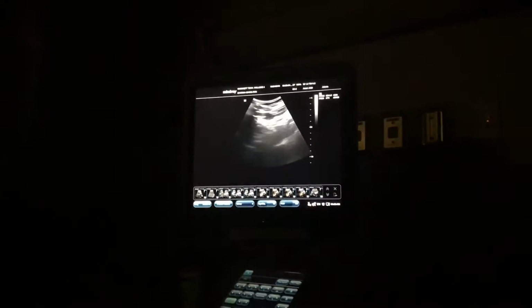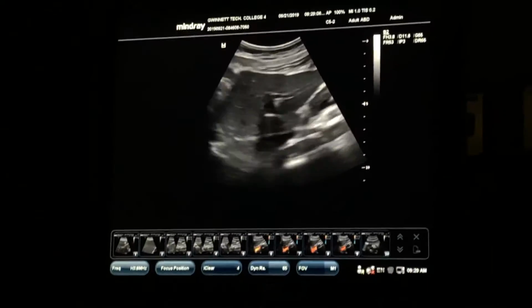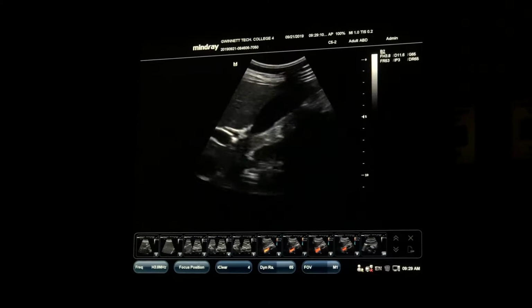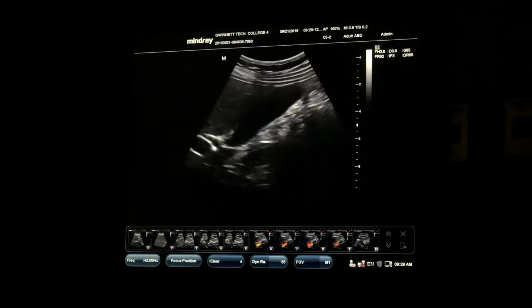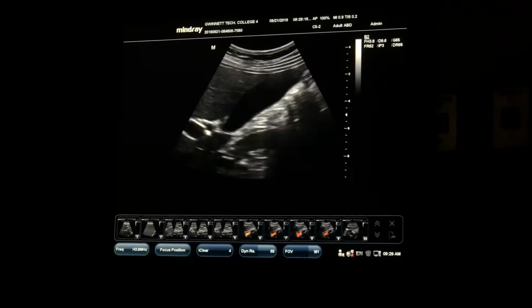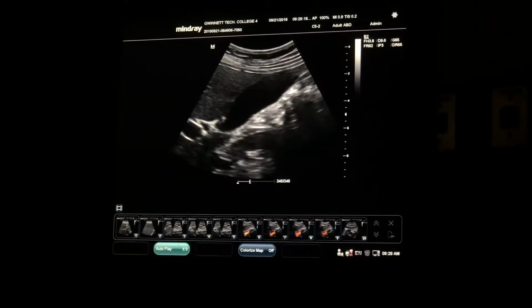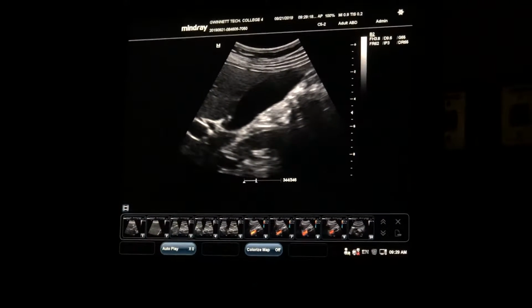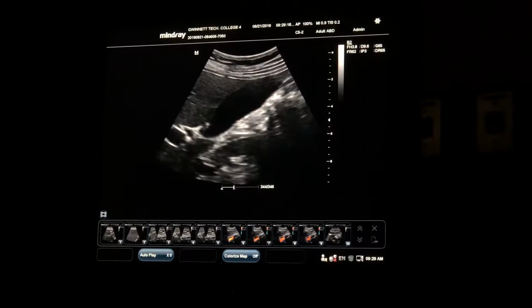Supine, we're looking at LLD, big deep breath and hold. So, long gallbladder. The name of the game for the gallbladder, in my opinion, is to make sure that you elongate it fully, that you evaluate it fully from multiple windows, because I promise you, breathe, that if you just look from one spot right here and it looks beautiful, you're gonna miss something.